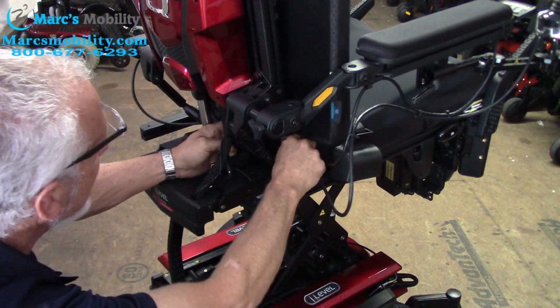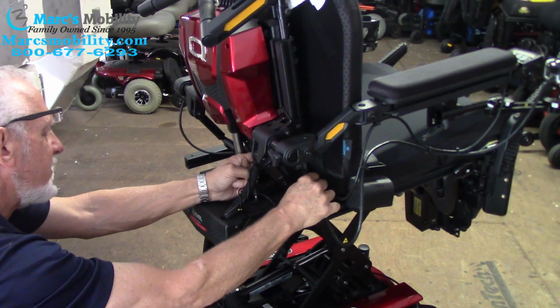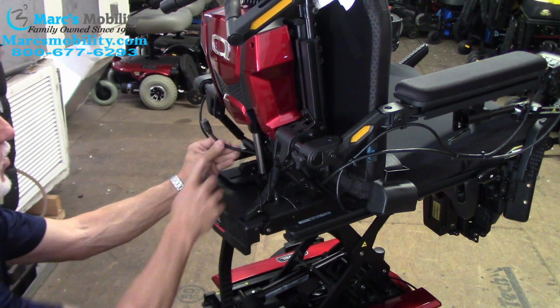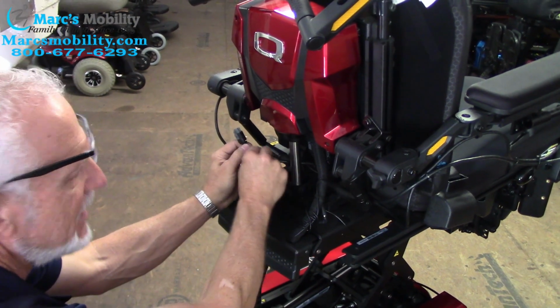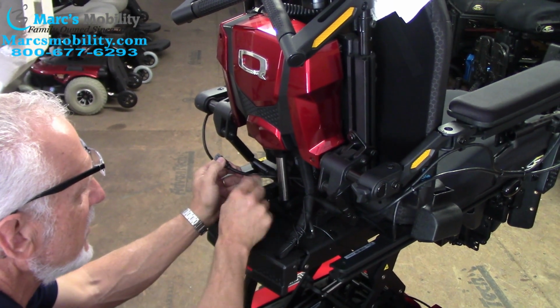It went through, so it's got to come out. So this one has two wires, so I'm not going to spend a half hour here trying to pull it through, but yours should come pretty good. On your wire also, on your wire right here that's plugged in right below this box, you have a piece of white tape. It has a little note on a white piece of paper. Cut that off, okay? So it's going to be easier to go through.